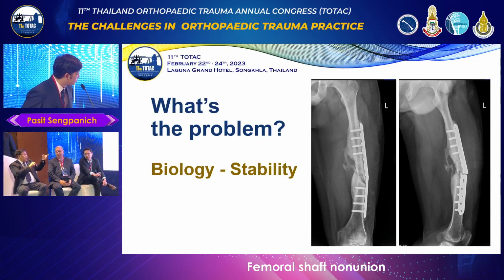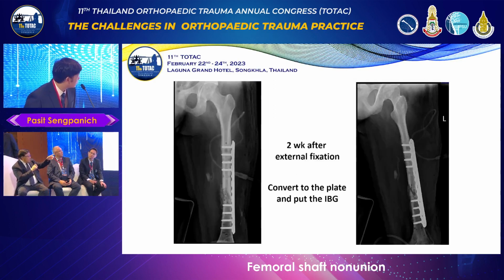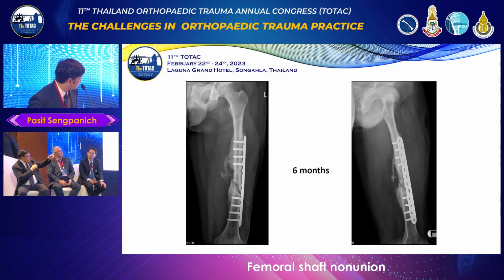May I look at the post-op of the second operation? Okay. This is 1 month. And then next 6 months. I think the gap is getting wider. Right? The gap is getting wider.